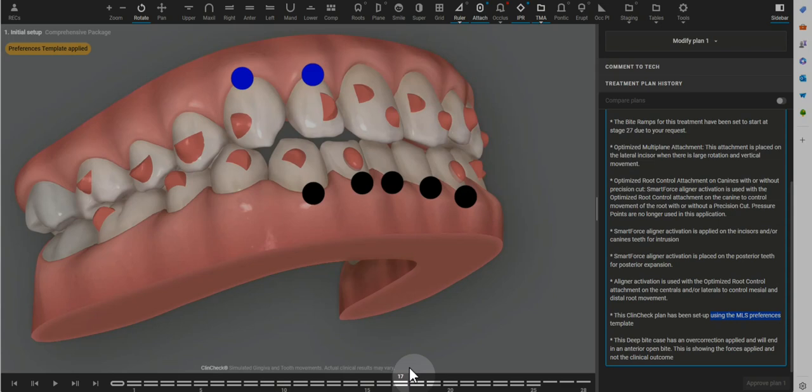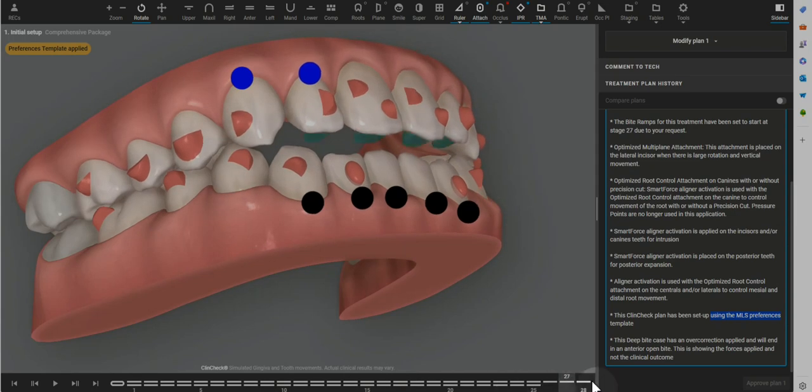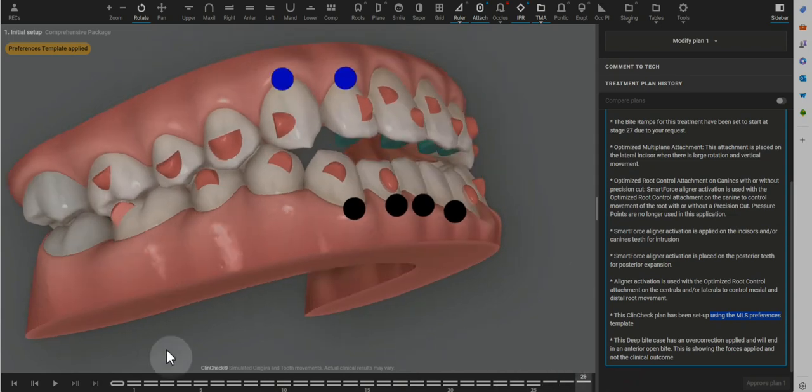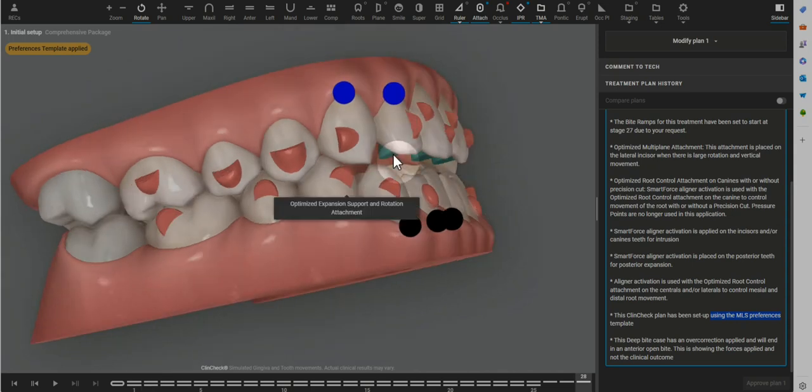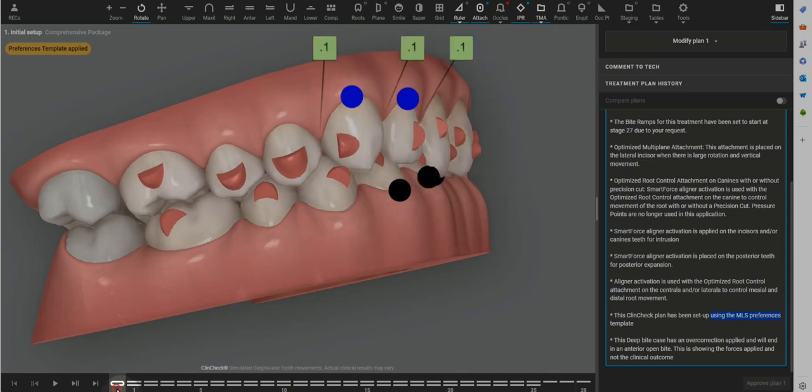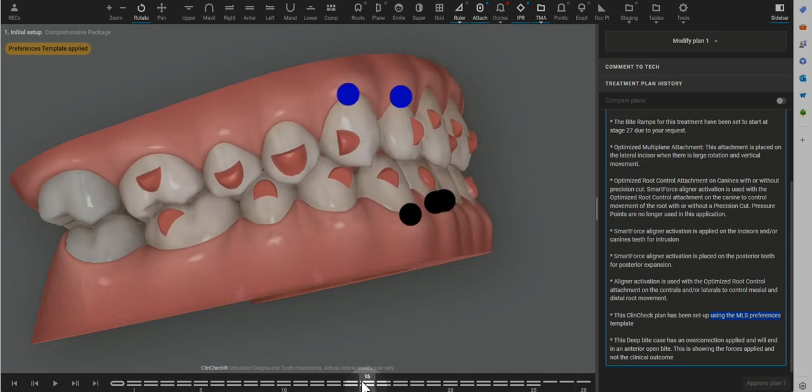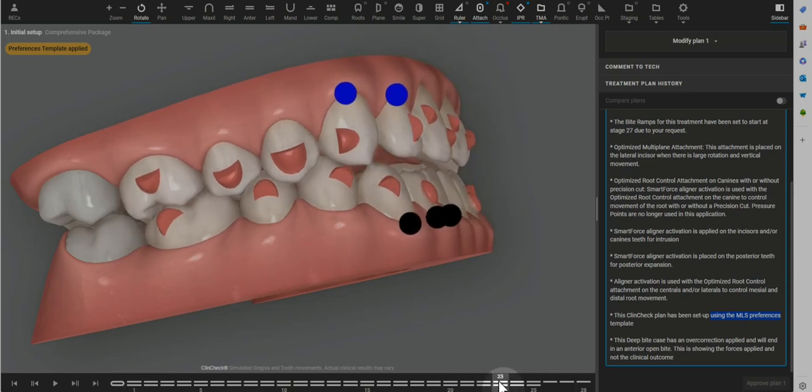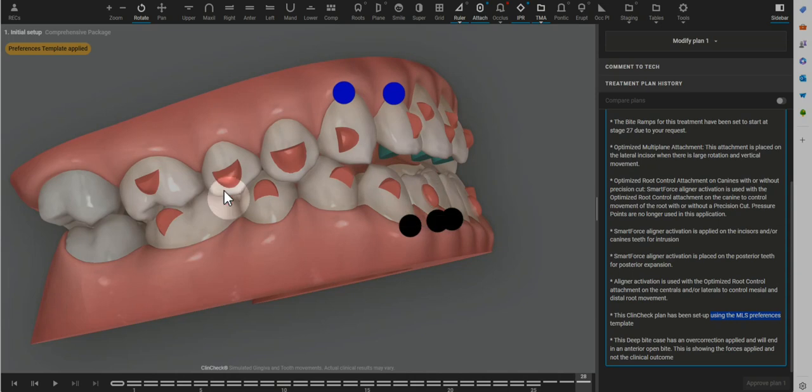They can act like a flat plane or act like a deprogrammer, which can be more comfortable for the jaw joint. And with good compliance, any lisp that a patient may have with bite ramps goes away pretty quickly as long as the patient's wearing the aligners really well. So that being said, doing the extrusion of the molars shouldn't be really necessary if the bite ramps are being used all the way through.